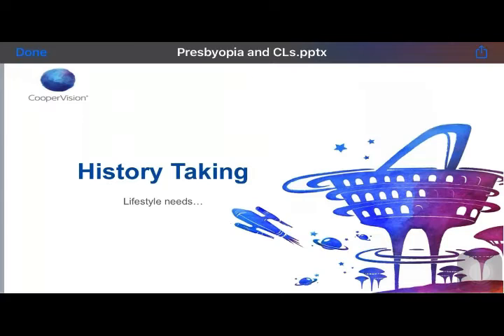Those are all very good questions if you are doing a diagnosis as well as when you are doing a refraction. But if you want to incorporate multifocal lenses in your practice, you have to understand the lifestyle needs of the patients. Because you have to know that you are dealing with patients who are 40 years old. They are not impulsive buyers. If they don't require the contact lenses, they might not take them. So lifestyle needs are one of the major factors for your patient. So you have to ask them about their lifestyle needs.